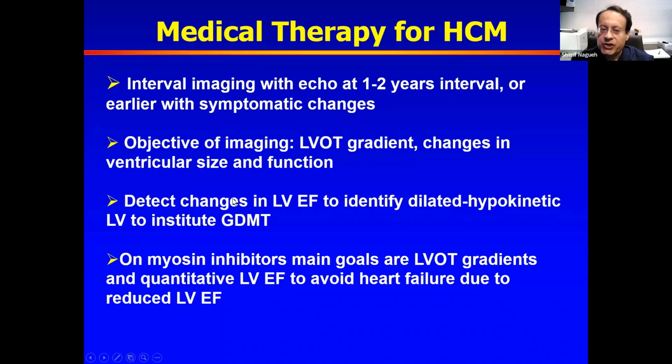For ejection fraction, you want to see if the ventricle has entered the dilated hypokinetic stage, in which case they receive guideline-directed medical therapy. More recently, myosin inhibitors have become available, and here the main goals are really what happens to the gradient on treatment, as well as quantitative ejection fraction, so as to avoid heart failure due to reduced ejection fraction.